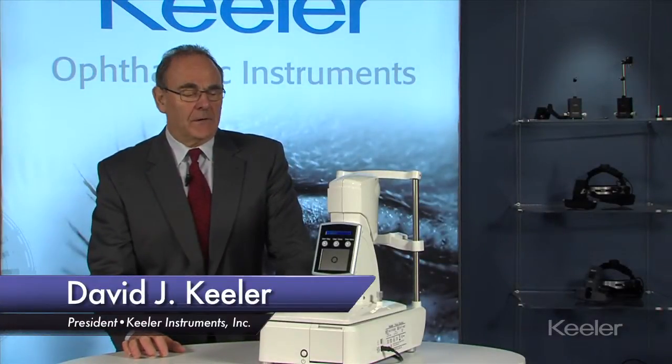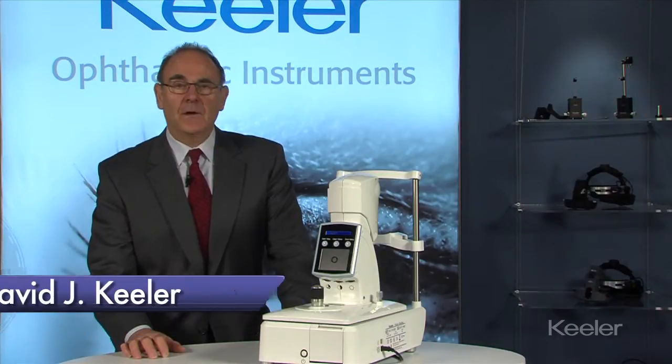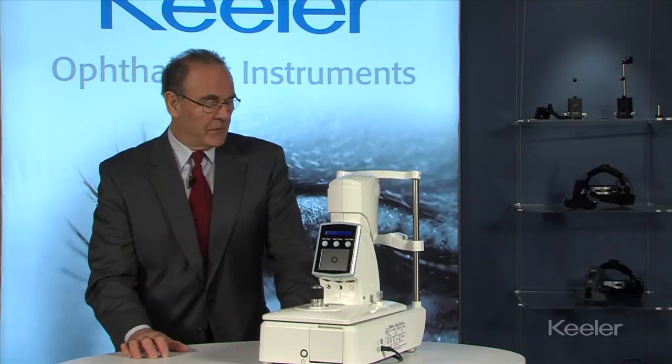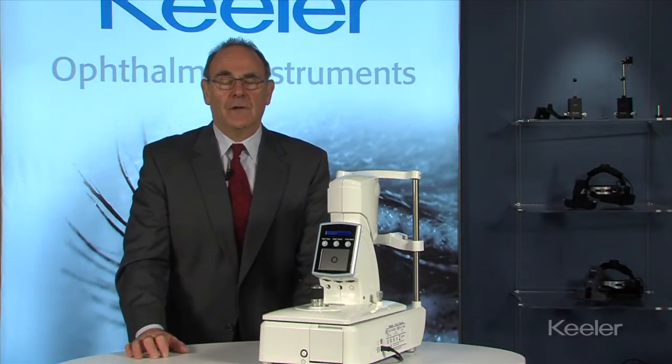I'm David Keeler and this is our desktop Pulsair tonometer. It's the third in our range of tonometers and very recently introduced. It uses the same software as the very successful Intellipuff device.